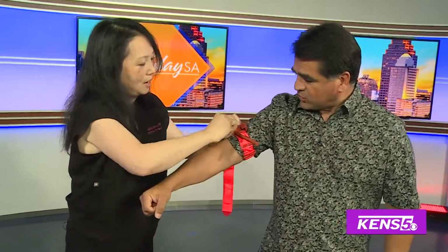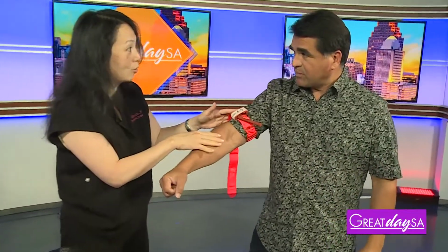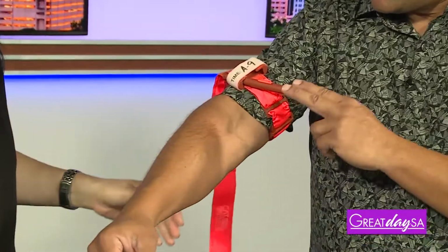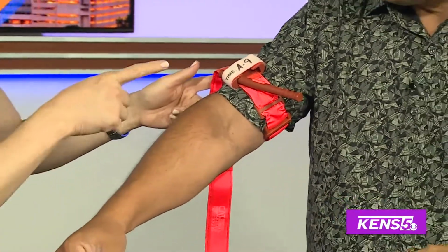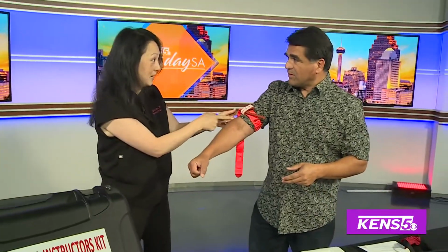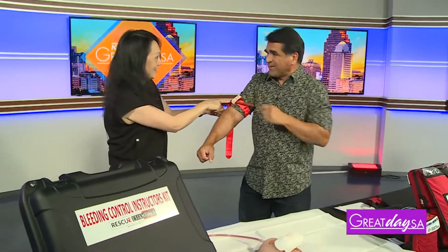Wow, that is really good. And now it's going to hurt. Yes. Remember, you're going to reassure the person, hey, it's okay, it's going to hurt, but I'm stopping the bleeding so EMS can get here and take you to a hospital. So now, how quick do you have to take this off, or you might have permanent damage? You got 6 hours, but remember, if I don't put this on, you could bleed to death in as little as 5 minutes. So I got to put this on. I think I'd rather have this. Okay.